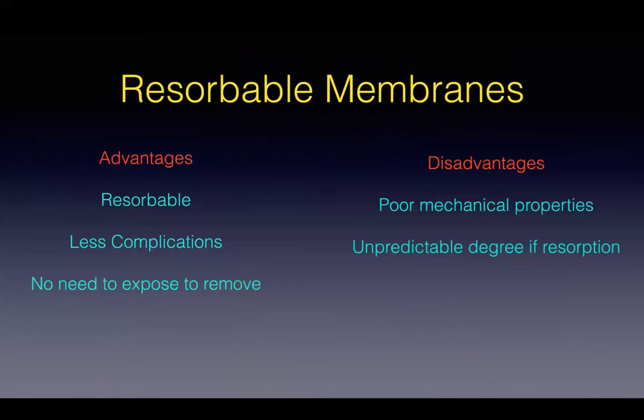The advantages of resorbable membranes: less complication, and they don't need to be exposed to remove. Disadvantage though, a poor mechanical property, and it's unpredictable with the degree of resorption.